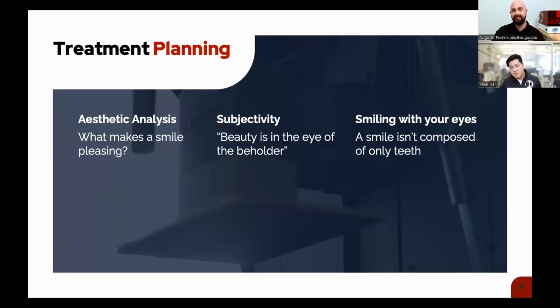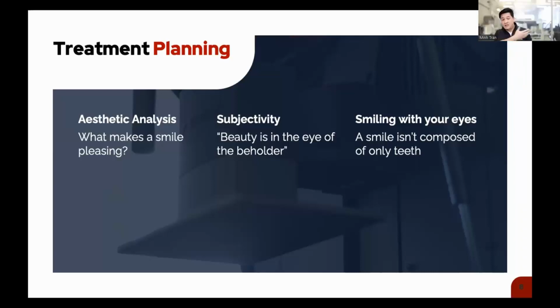For the majority of the history of dental technology, us technicians, we're at the bench, you get maybe an articulator. If you're really lucky, you get a face bow record. But all you see is just some teeth, and they're mounted on a cast that really doesn't tell us anything about the patient's aesthetics. So we really need to factor in how the rest of the face acts in harmony with this smile that we're designing with the dentition, so we can achieve an overall aesthetic result.